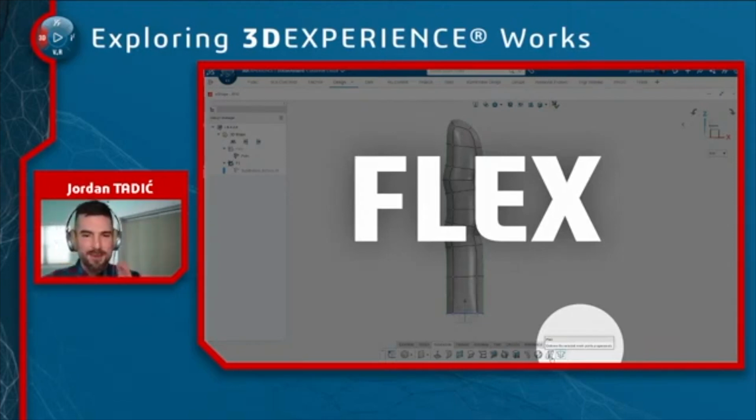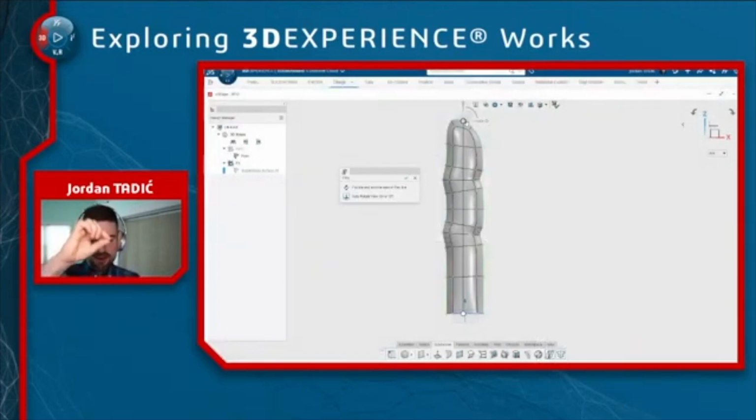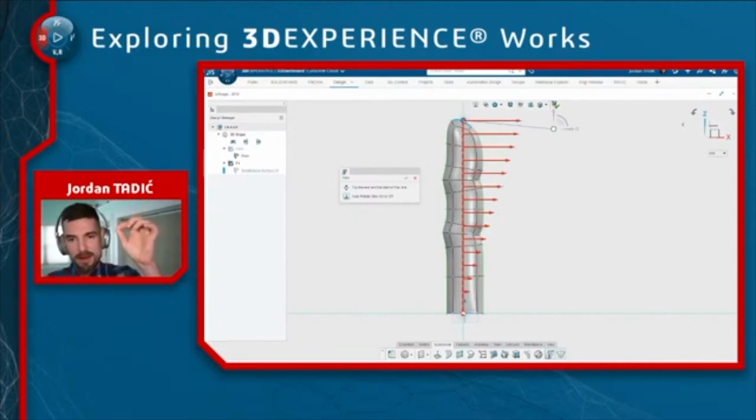But the flex command is going to take some explaining so you can really understand what's happening here. So what you see here is a vertical line. I'm dragging that off center on purpose right now in the robot. The vertical line that I'm dragging into place is defining the range of influence of the tool. So maybe if I just wanted to bend or flex the top portion, I could shrink the length of that line. But I want this to go across the entire length of the finger. And then you'll also notice that the robot has a little line connecting itself to the top, to just tell you that that's where the robot is. And by robot, I mean the little manipulator, the triad thing on there. And that is where the main influence is going to be applied.